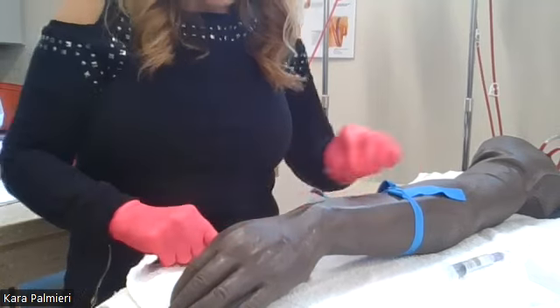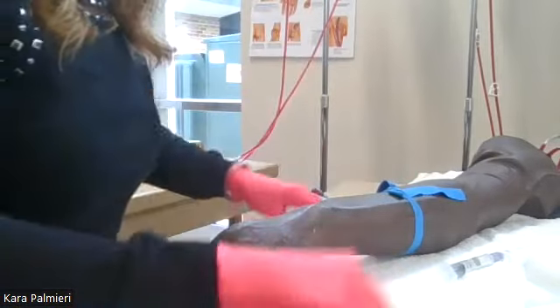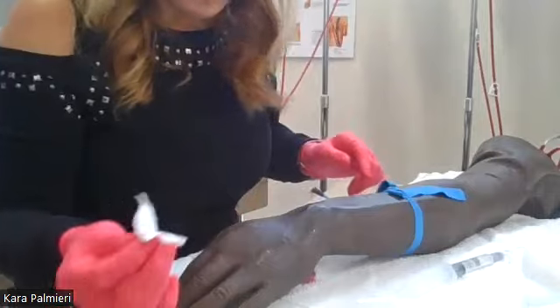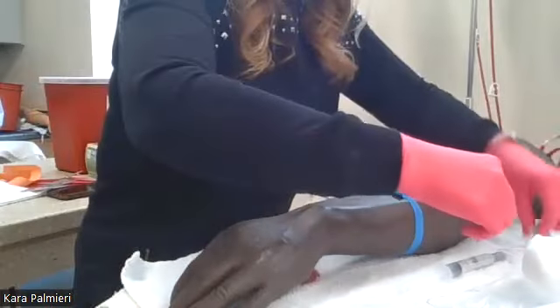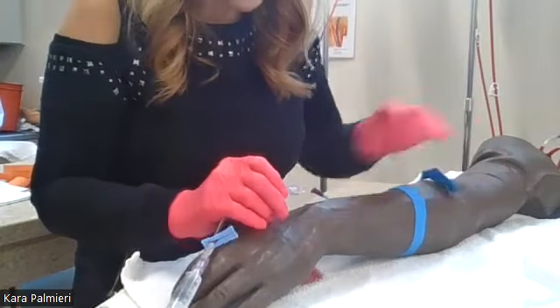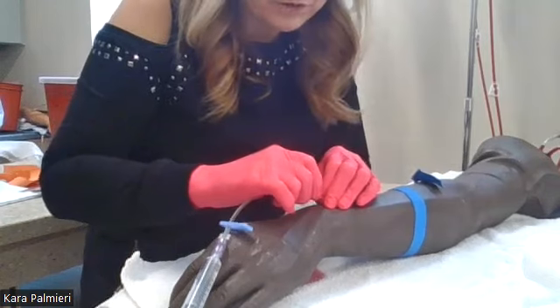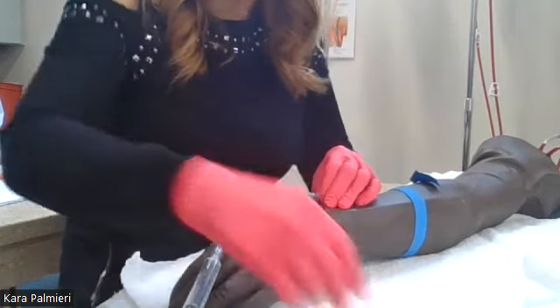Okay. See how well that's bleeding? That's a good IV. Okay. That's why they give you these lovely little 2x2s, because as soon as I connect this, which I'm going to do now, pop your tourniquet off. That'll help stop that flow. But when you see that, you know that you have a really good vein.